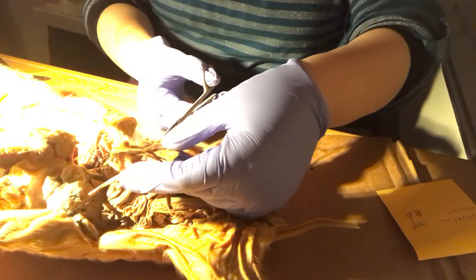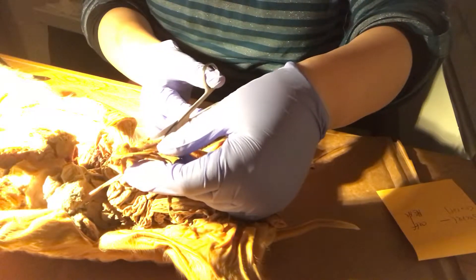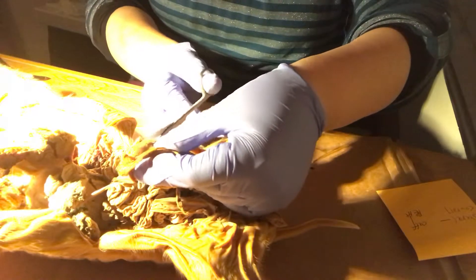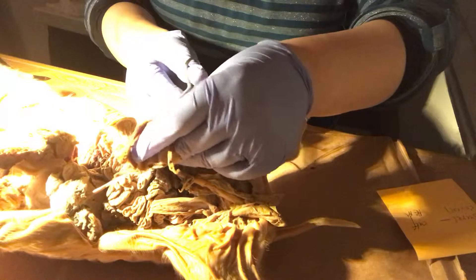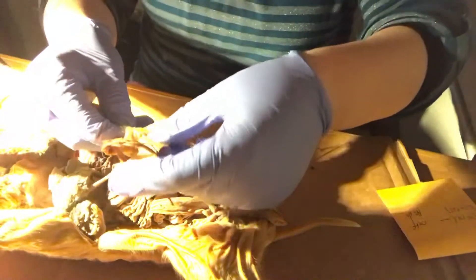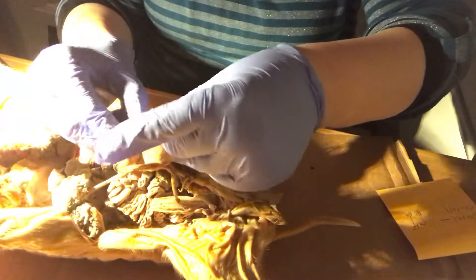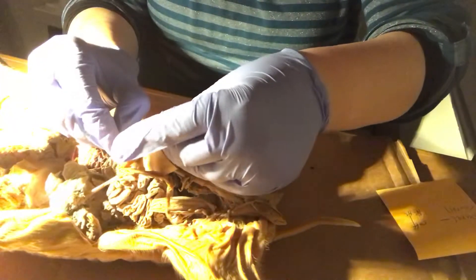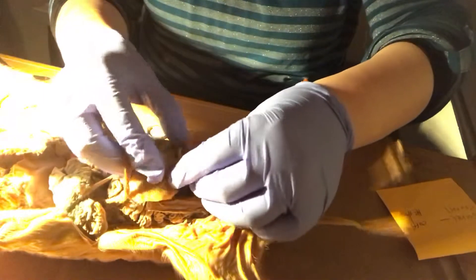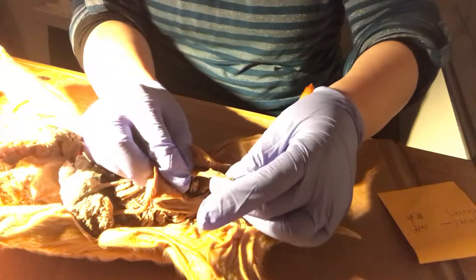Let me cut in on one side of the skin. And here, this is the penis.